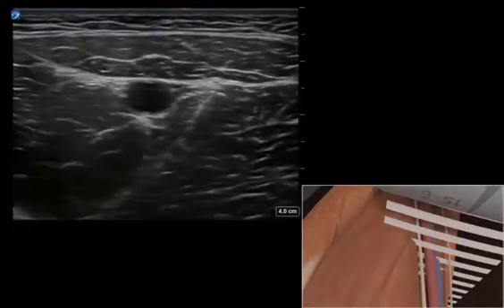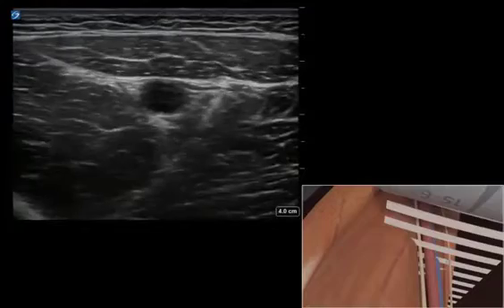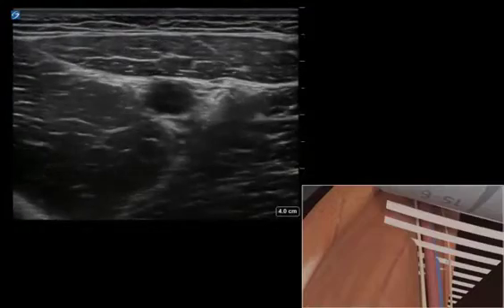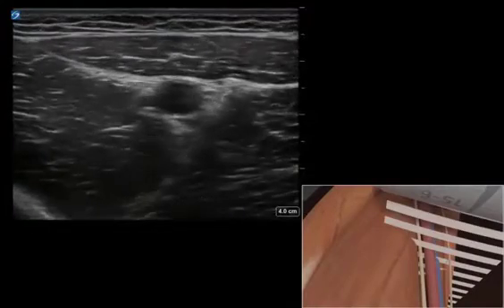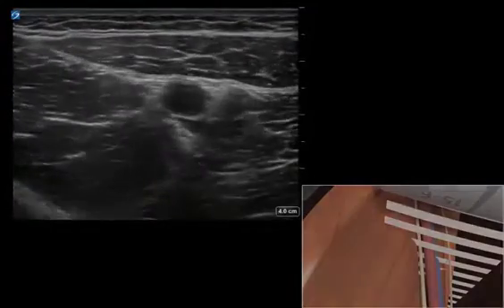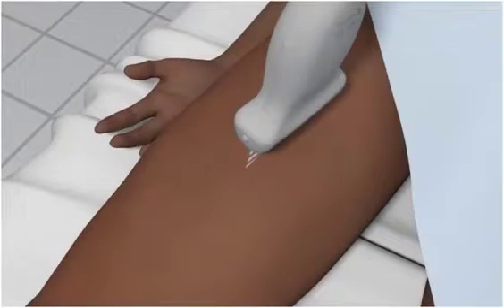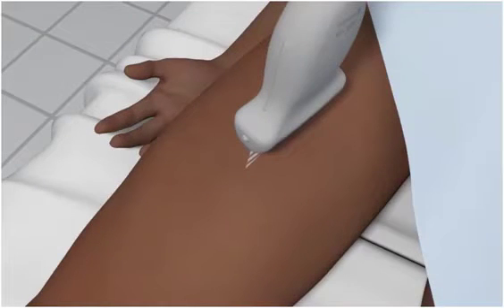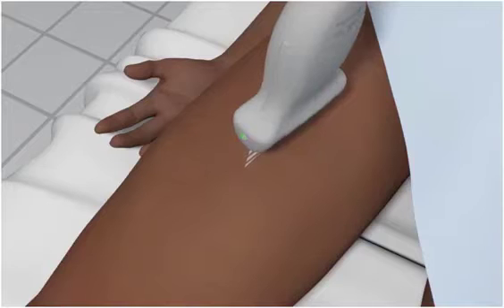A high-frequency linear array transducer with a nerve exam type is used to perform an adductor canal block. The patient is positioned in the supine position with the leg slightly externally rotated.